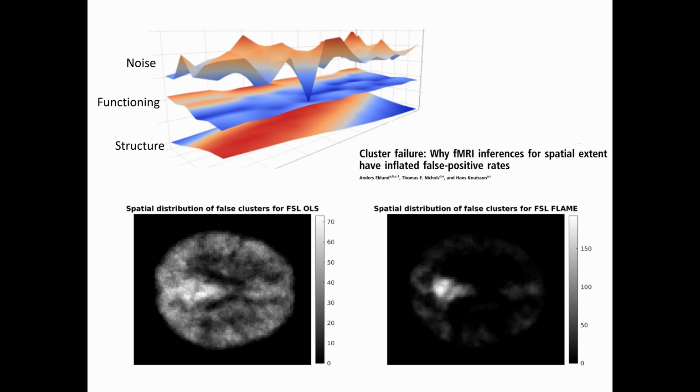An example of a standard least squares is on your left. I'm getting better at laterality, that's good. And you can see there's an increase in the default mode network area, which is super encouraging because that's exactly where a lot of the data comes out and is published, this area that has a high rate of false positives. So that's comforting. You can control for that more with permutations, but you can still see that's an area of concern. So not all areas are successfully controlled in an equal way. You need to be cognizant of it.